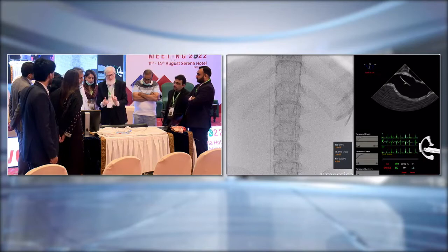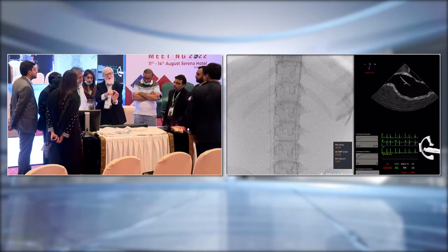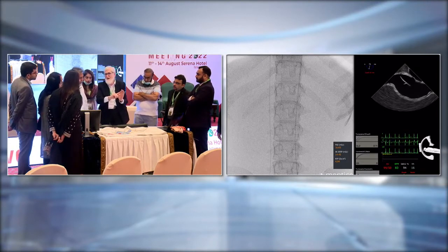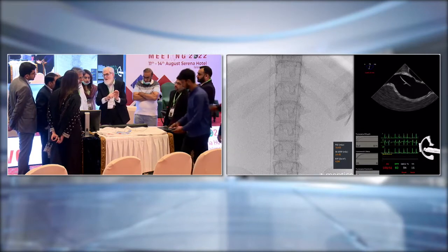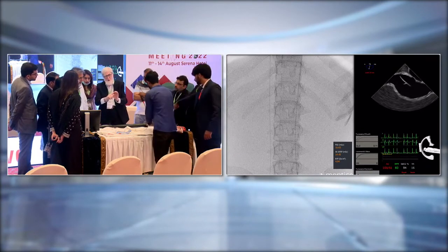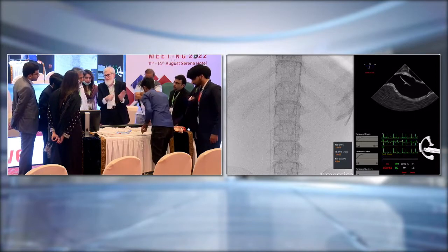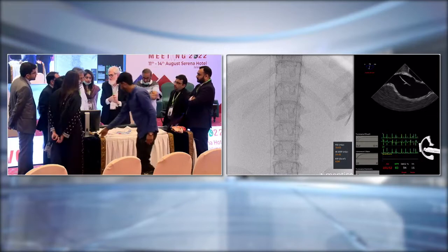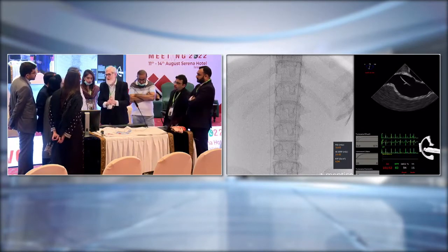Sometimes what happens is that this is the vein, the iliac vein going like this. We put the dilator like here. The dilator comes at the tip of this, so the wire doesn't go. The trick is that you just slightly pull back and the wire will move up. You understand this? Yes. So this is practical life.